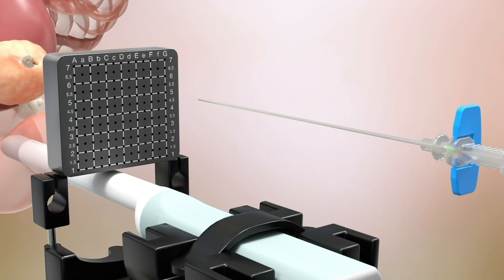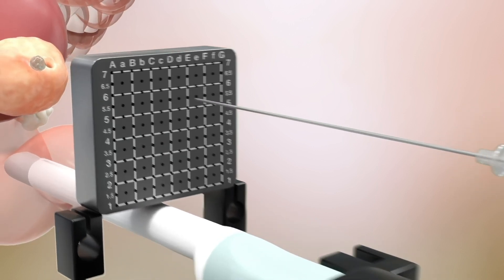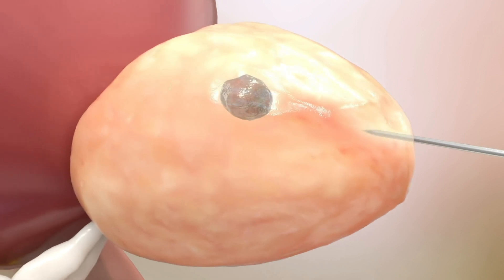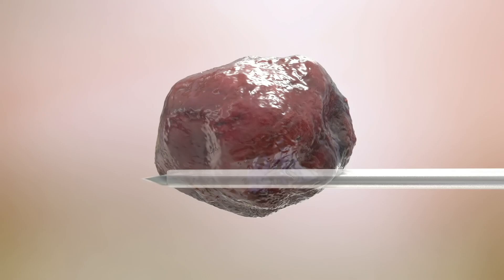Using given template coordinates, the doctor then inserts the laser catheter with the stylet via transperineal access into the target coordinates to the proximal edge of the tumor. The stylet is removed, and the laser applicator is inserted into the catheter and locked into place.